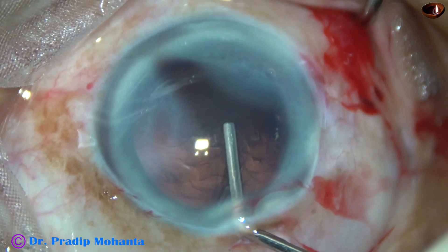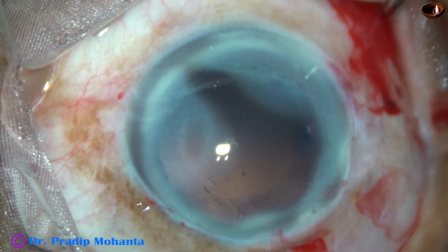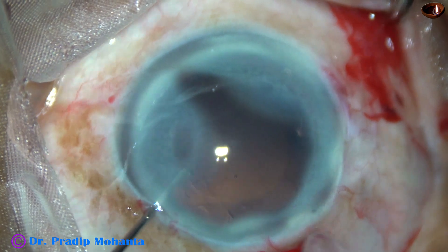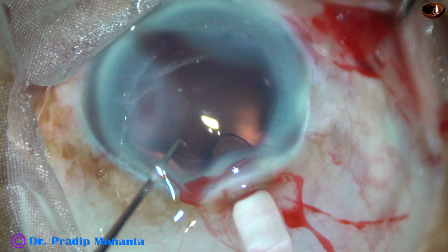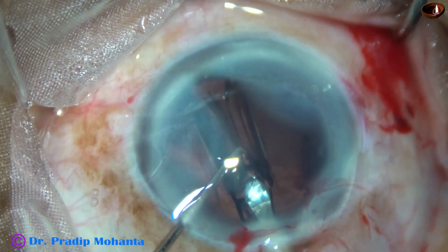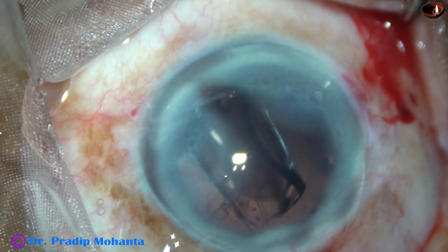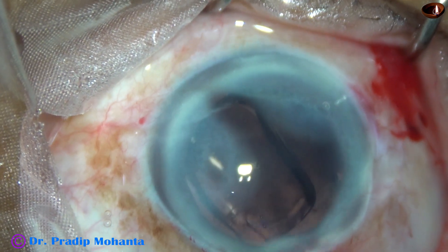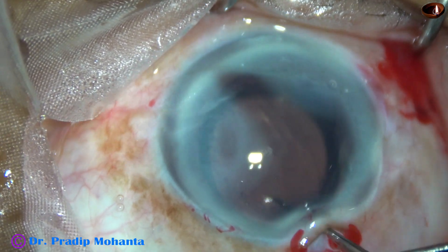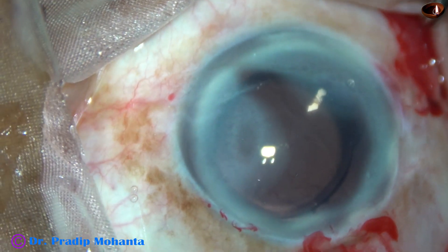And now the anterior chamber and capsular bag is filled up with visco. This is a hydrophobic acrylic single-piece monofocal intraocular lens — it goes into the capsular bag. This is the Tecnis 1 from Johnson & Johnson. No financial interest — just to inform you what the lens is.